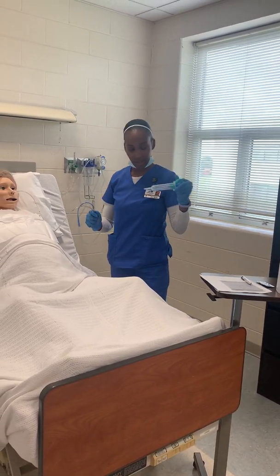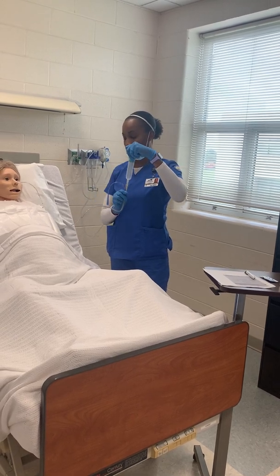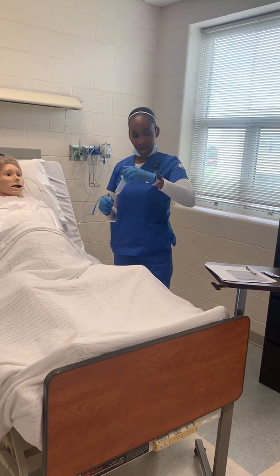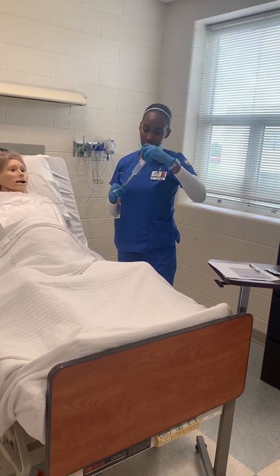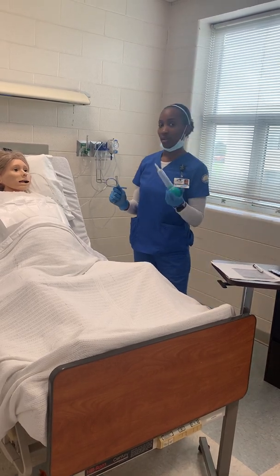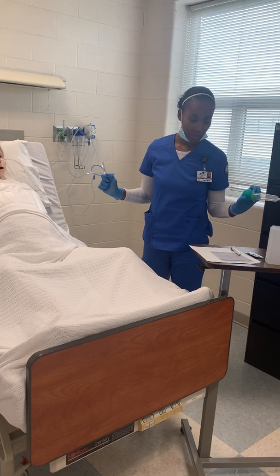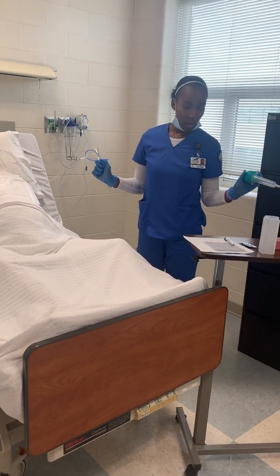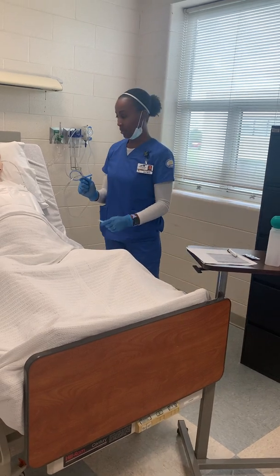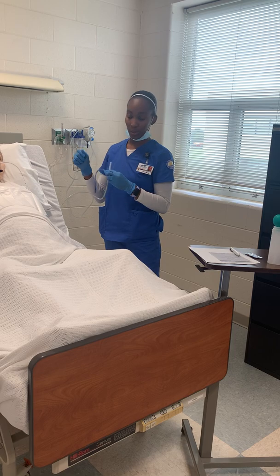All right, got my saline. Put it in. Let that run through, and then I'm going to aspirate out some contents, put it in the basin, and I'll do that until it runs clear. Then I will go ahead and hook her back up to suction if she needs to, or just clamp it.